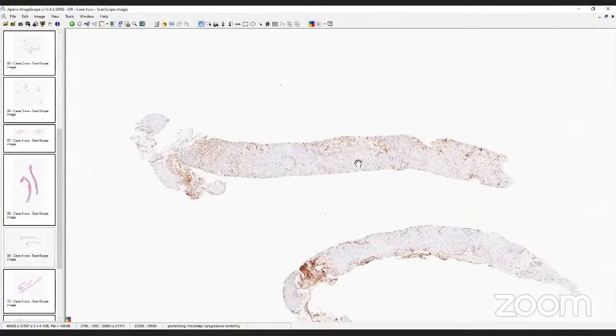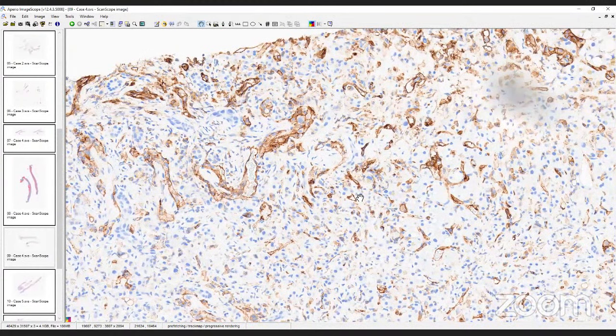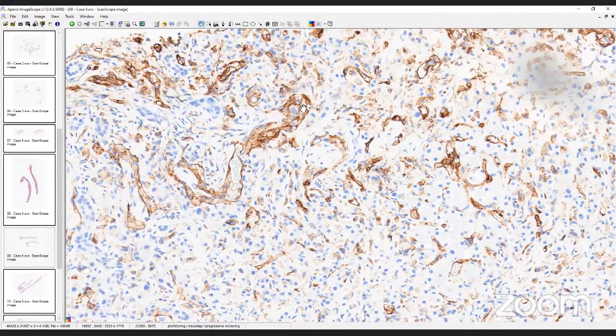And so I did a CD31, which is this stain here. And what I've noticed in all these cases of epithelioid hemangioendotheliomas is that when you do a stain for the endothelial marker, you always see more cells than you were able to appreciate on the H&E. And that's what we're seeing here. For example, you have these very big, ugly nuclei that are marking for the CD31. And these are all malignant cells. Although I saw malignant cells, or very suspicious looking cells, on the H&E, I don't think I saw this much. So the stain will always mark out more cells than you are prepared to see, almost.